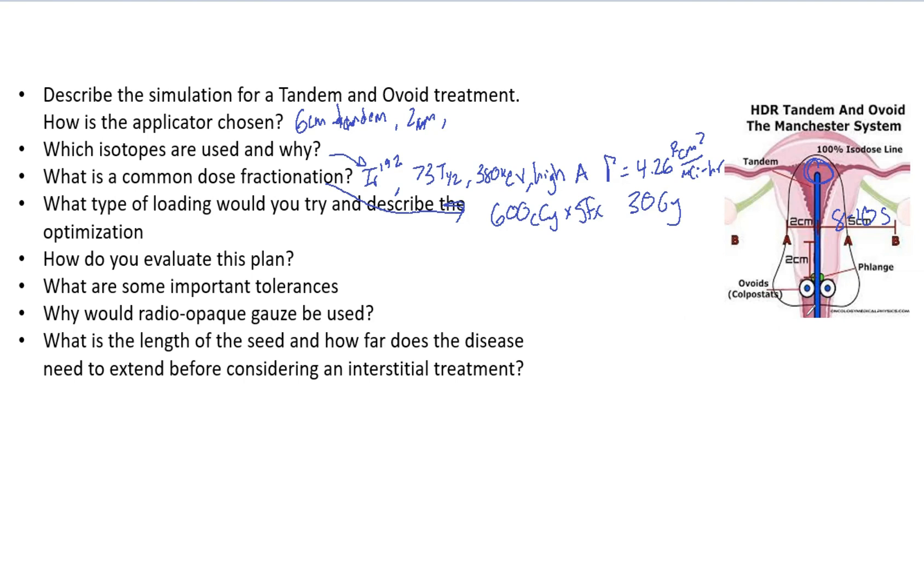How would you evaluate this plan? If you're doing a second check, you want to look at the coverage of the PTV. You also want to look at the regions of interest - the bladder, the bowel, all of the other surrounding organs, the rectum. You want to use an equivalent dose sheet because typically these T&O treatments, they are going to get external beam either as a boost or they've had external beam and they're getting a tandem and ovoid boost.